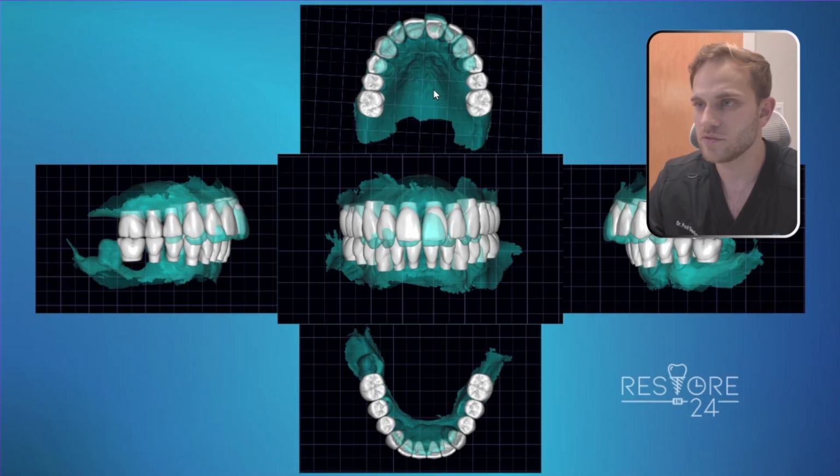So here's another view of the different types of pictures of our 3D renderings of the patient's previous smile. In the blue is what we have in the beginning, and the white is where we propose to put the teeth. So we wanted to bring everything a little bit back from where it was before. It's a little too pushed out in the front, but in the back teeth we want to push those out, actually give her back teeth, and then on the lowers we want to move everything out to match with the uppers. So that's what this all shows here.